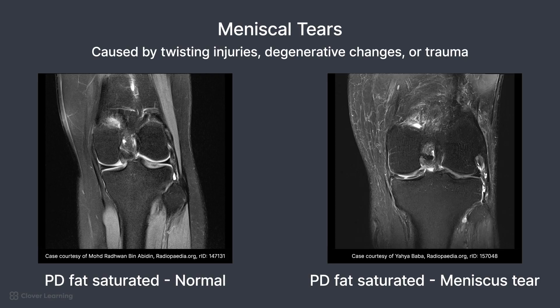On the first image, you can see the dark, wedge-shaped medial meniscus fully intact with uniform low signal. On the second image, you can see a bucket handle tear with a high signal defect extending through the meniscus, indicating a clear disruption.